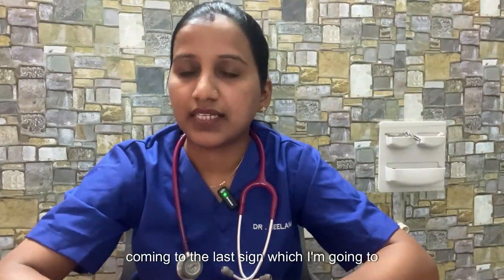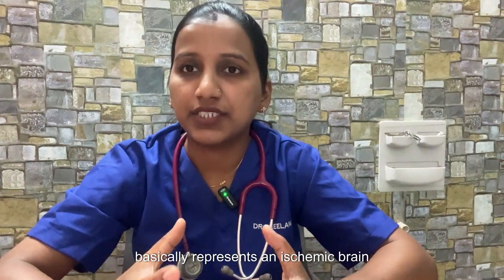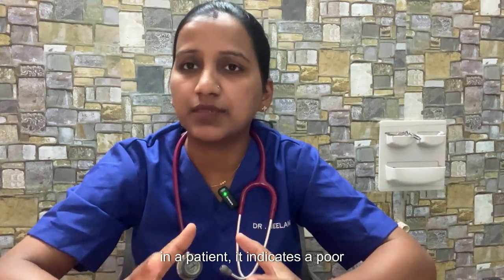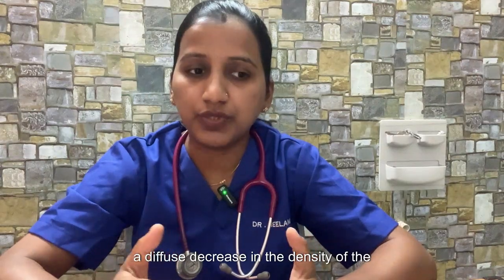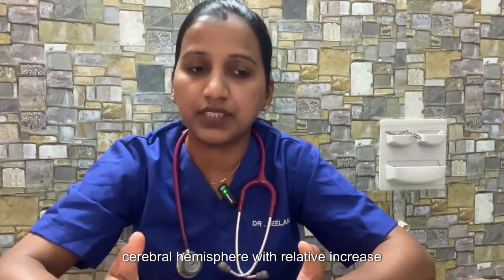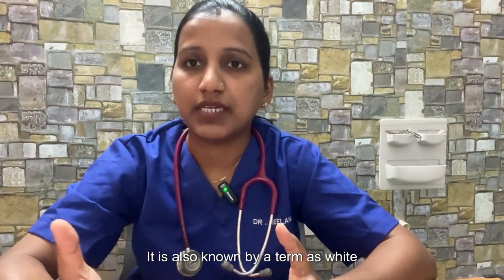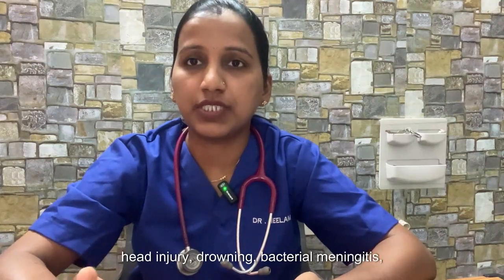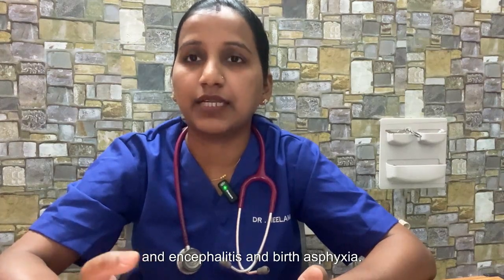And coming to the last sign which I am going to highlight today is the reversal sign. It basically represents an ischemic brain injury which is irreversible, and if seen in a patient, it indicates a poor prognosis basically. It basically refers to a diffuse decrease in the density of the cerebral hemisphere with relative increase in the density of the thalami, brainstem and the cerebellum. It is also known by the term white cerebellum. It is generally seen in cases like severe head injury, drowning, bacterial meningitis, encephalitis and birth asphyxia.